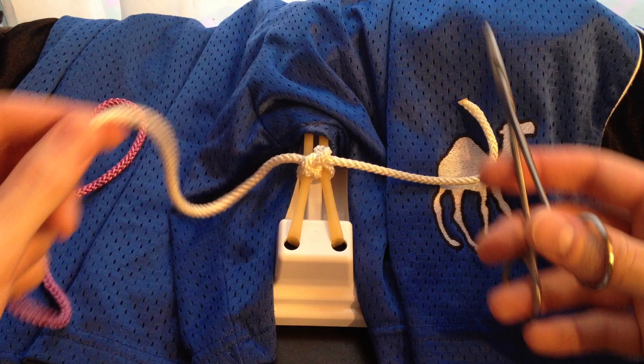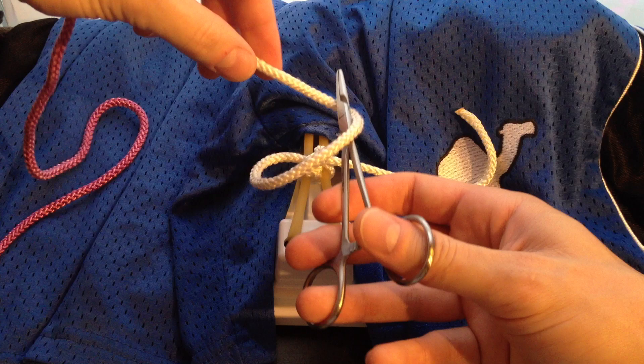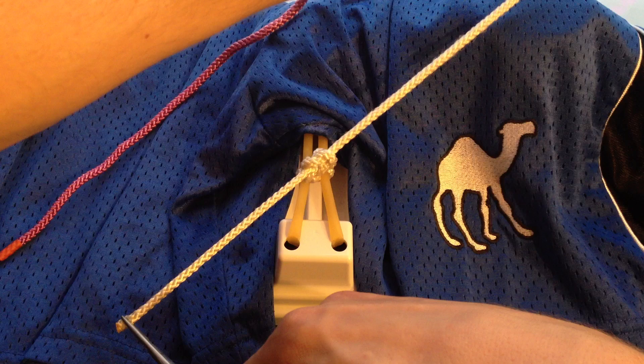So for the instrument tie, the technique is basically bouncing your hands back and forth with one loop around the needle driver and pulling the short end to the opposite side. So let's do this one more time: lay it down the middle, loop it once, grab the free end, and pull it to the opposite side.